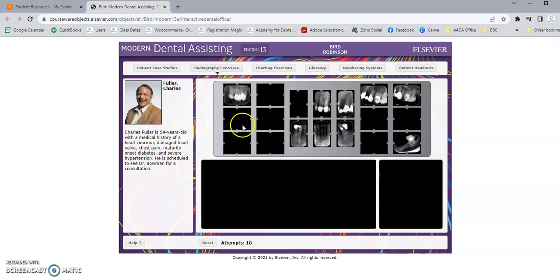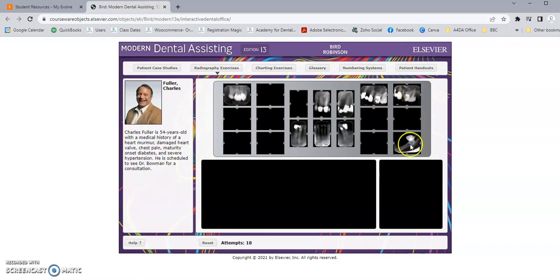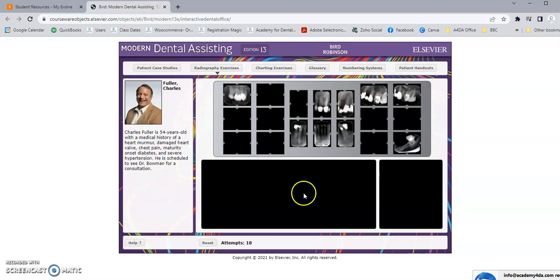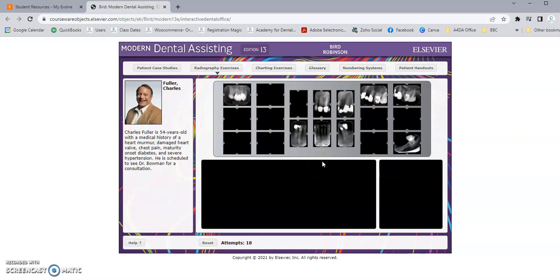If it's not the correct spot, it won't lock in there. Try to know your anatomy of your teeth — very small teeth tell you those are lower anteriors; look for the sinuses; look for three roots or two roots. Then it's kind of like a puzzle: if you have one or two placed, you can see what the next one should look like — maybe there's a bridge or a missing tooth in that area. You would screenshot it, save it, and send it to your teacher. I hope that helps with explaining how to do the Interactive Dental Office on Evolve.com for your radiography mounting x-rays.